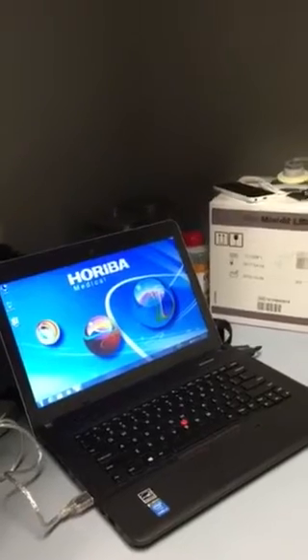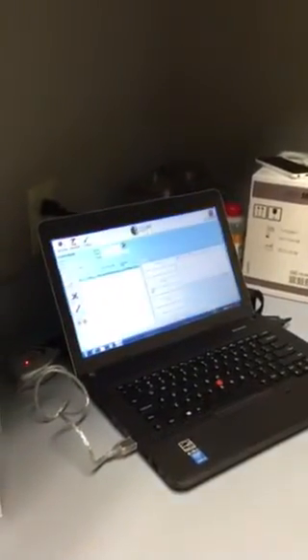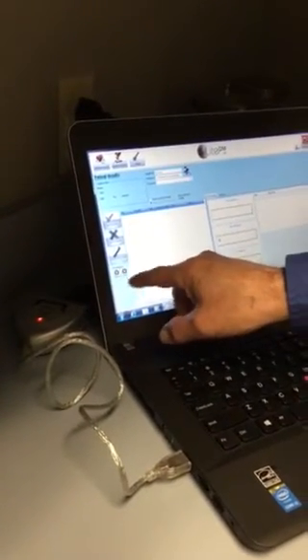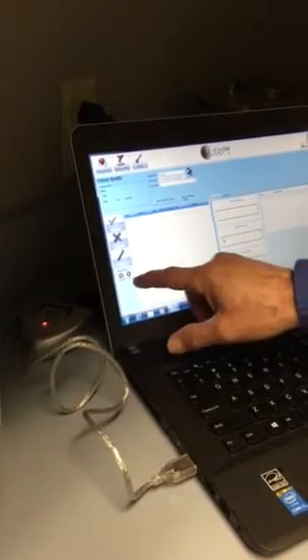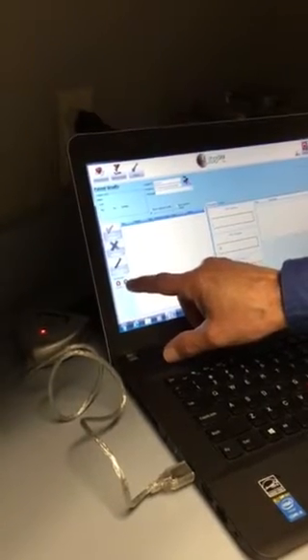This screen will come up and you're going to see both of these icons are red — the startup and the controls. We want to get them to go to green. When you have a passing startup, that will go to green, and when all three of your controls are passing within range, that'll go to green as well.